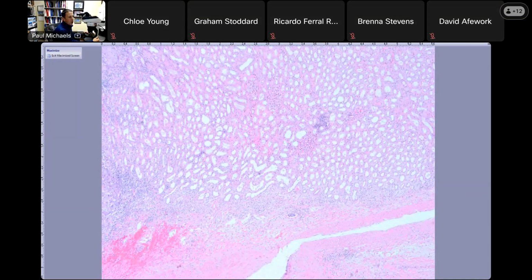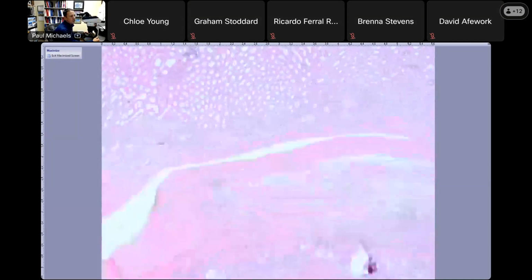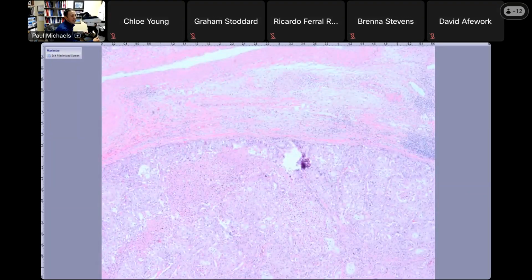I talked about how vascular tumors, especially epithelioid angiosarcomas, can have a lot of neutrophils.